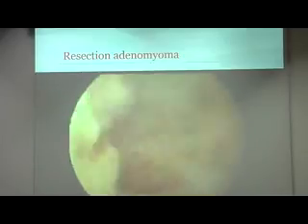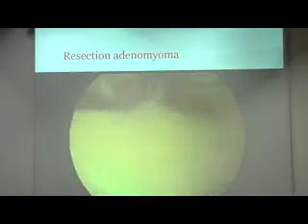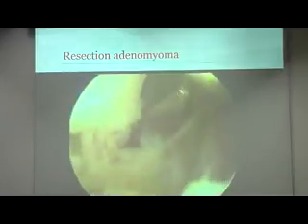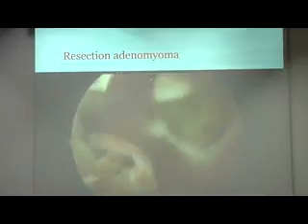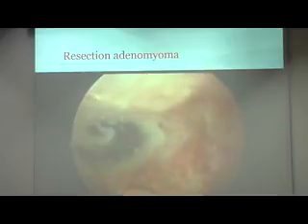But at the end of the surgery, you see at the lateral wall, we removed the adenomyoma, which is muscle, but diseased muscle. We have a huge crater, but apparently we helped the patient, because she got pregnant afterwards. But it's no proof. Science is different. You need a lot of cases, and we do not have so many cases.